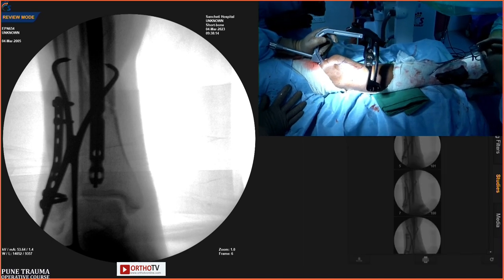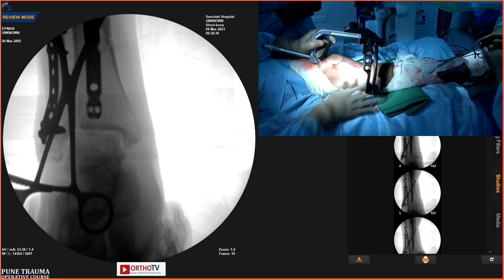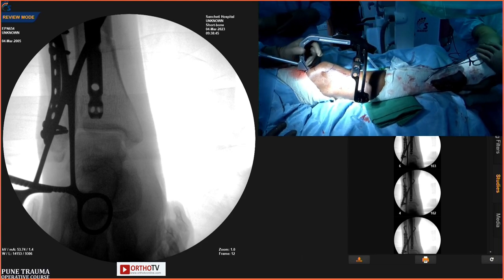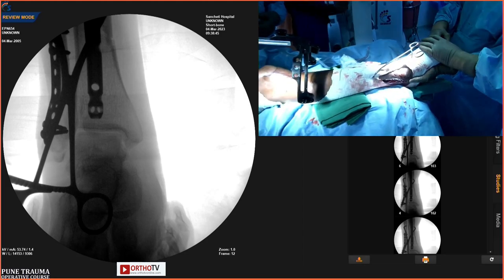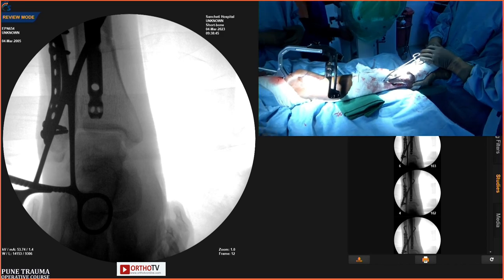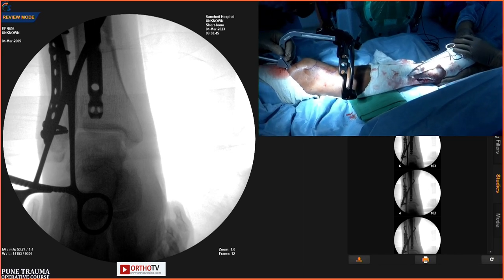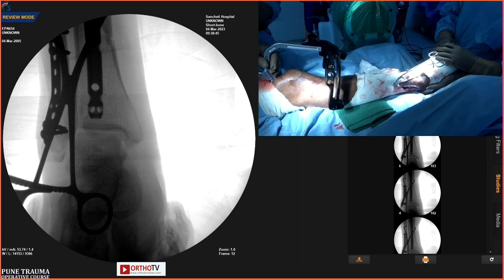This is the distalmost tip of the nail, and you can't go any further than that. Okay. Lateral. And the most important thing is to see the ankle plafond should be in the horizontal position. Actually, the nail tends to cause a valgus deformity that we have to see. Otherwise, you can put a Poller screw and then again redirect the nail and your guide wire and nail. So it's a very simple method.